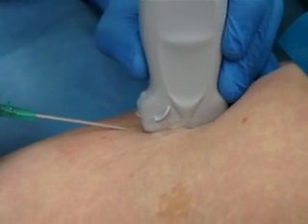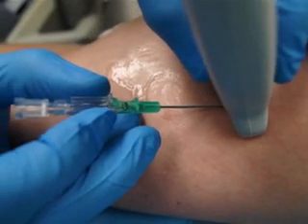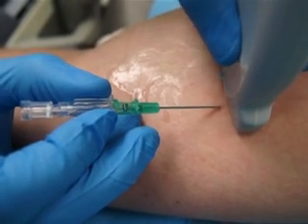We will review the proper technique for standard IV catheter placement and then demonstrate ultrasound guidance. We will limit our discussion to the upper extremity veins, but the same techniques can be used to cannulate any peripheral vein.